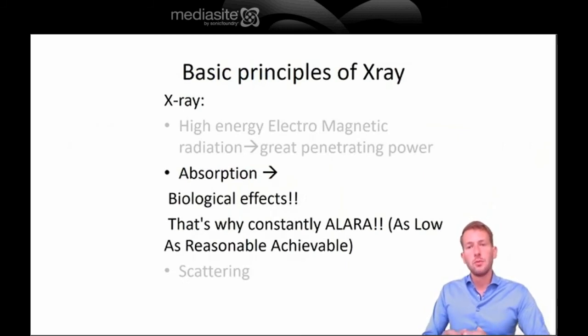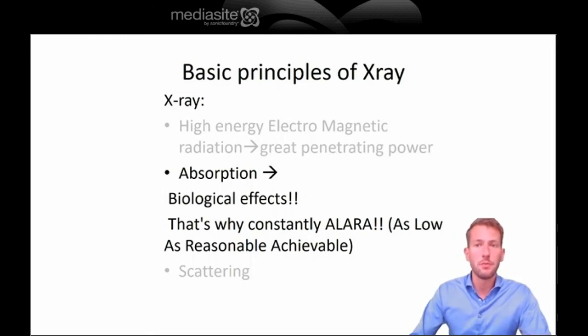All right, so the image therefore uses the fact that radiations are partially absorbed. We make grateful use of this, but there's also a downside, because the absorbed radiation can also cause biological damage inside of the body. Therefore, the ALARA principle is our main starting point when it comes to administering radiation to our patients. Really see this as one of the golden rules of radiology. ALARA, as low as reasonably achievable.